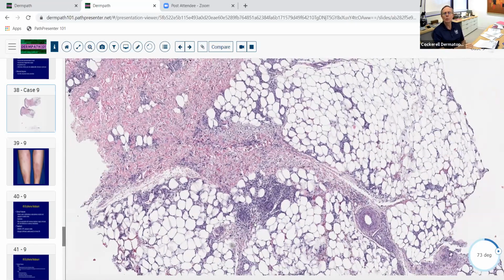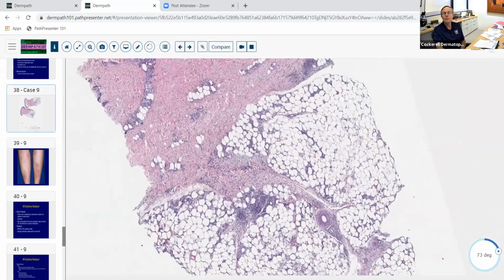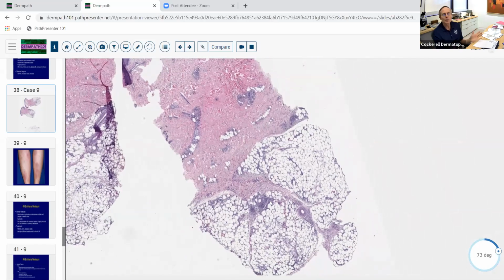If you see erythema nodosum really early, you may not get any granulomatous inflammation. If you see it late, most of it may go away. If you see it late, clinically, it can almost look like bruising, and in fact, the other name for that is erythema contusiformis. Looks like a bruise. So thickened septa, periseptal granulomatous inflammation, erythema nodosum. End of discussion. Sometimes things are just so straightforward, like 2 + 2 = 4. It can't be anything else. So you might do a stain to rule out an infectious disease, but it's going to be negative.